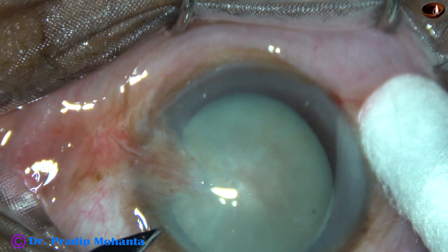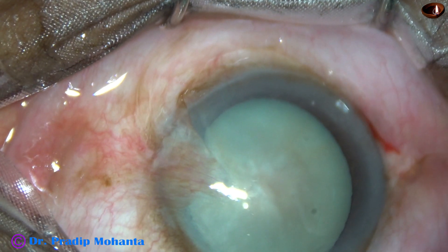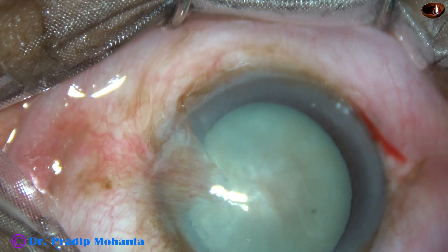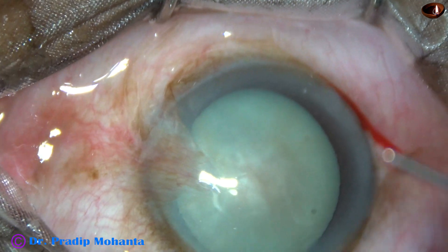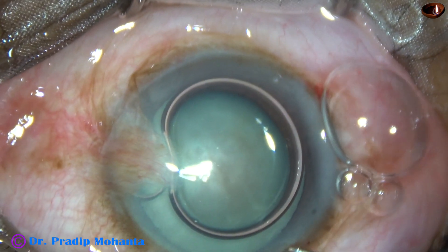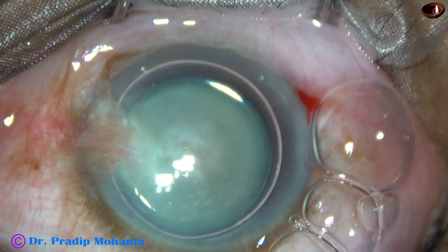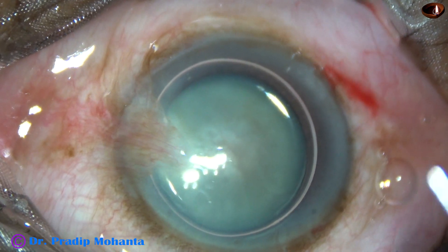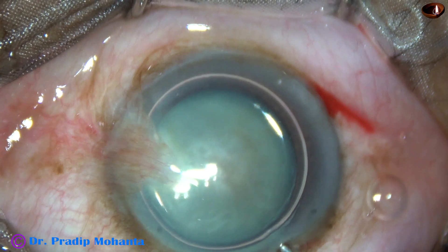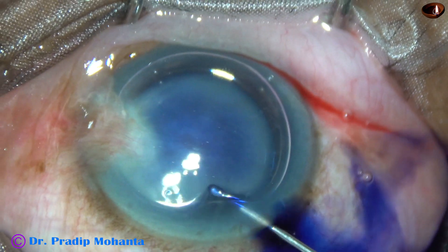Usually, when I do direct chop, I keep the bevel of the phaco needle towards the cornea. But in this case, the bevel was towards the posterior capsule, and I could do a nice job, and the nucleus divided into two hemi-nuclei completely. Let us observe this surgery.